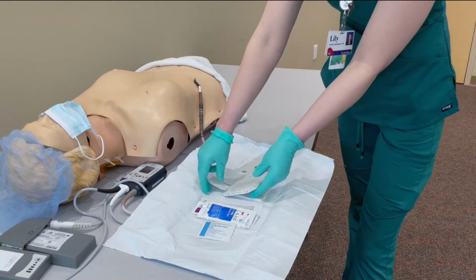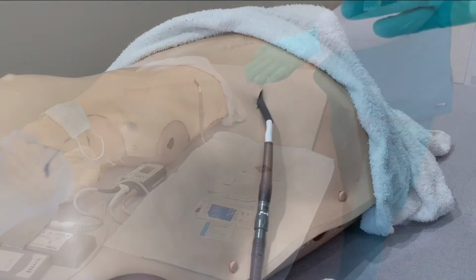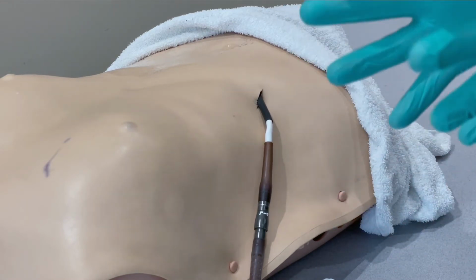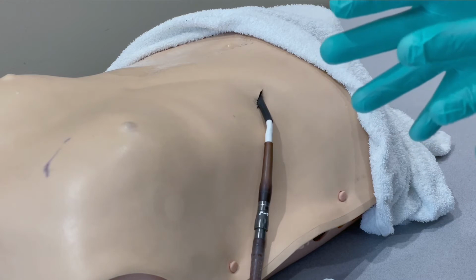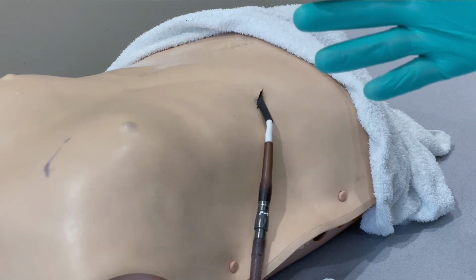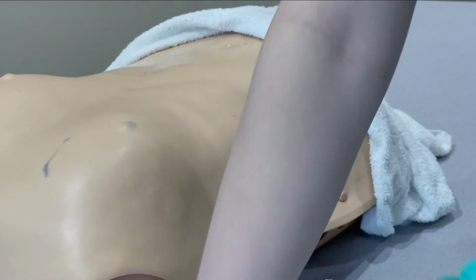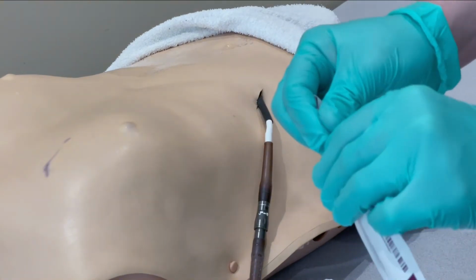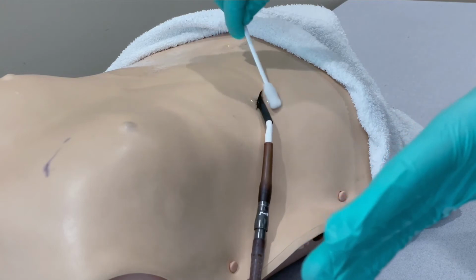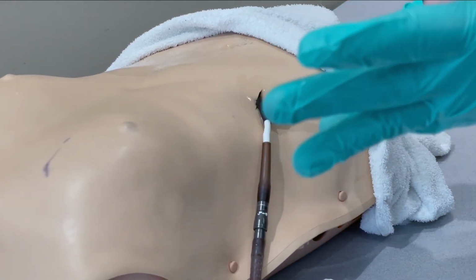So now I will be going through how we're going to apply this dressing onto your family member. As you start going through the process of applying your dressing, I want you to always have your hands in view. That way you know you're not accidentally touching your body parts or his body parts and breaking your sterile gloves. Step 1, we're going to take our chlorhexidine lollipop, the first one. Open that up. And we are going to clean the site, going from the inside all the way out.